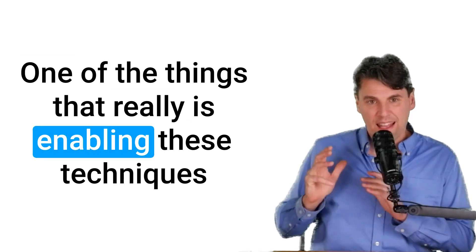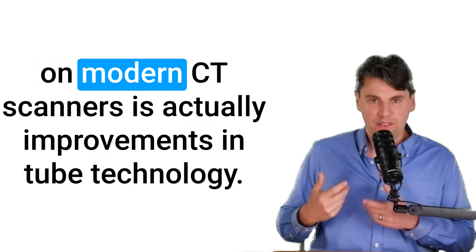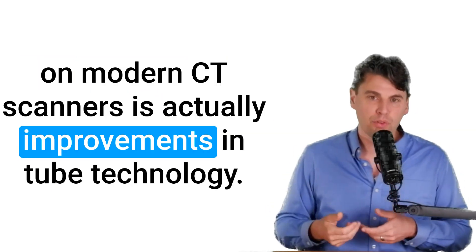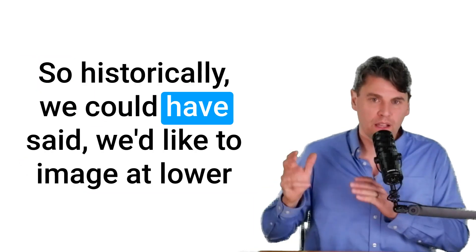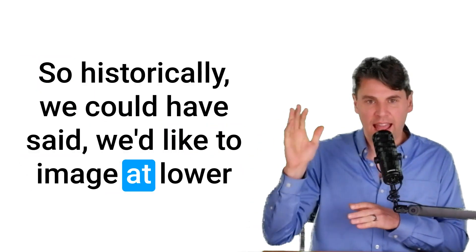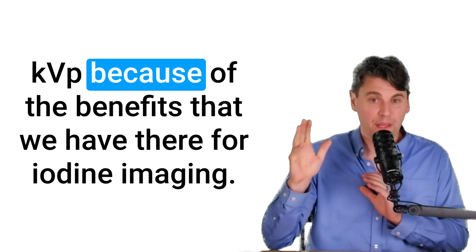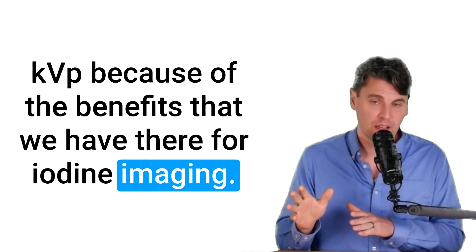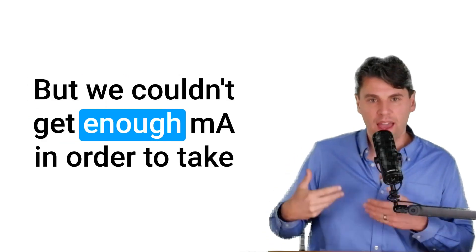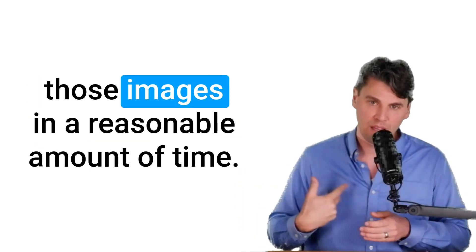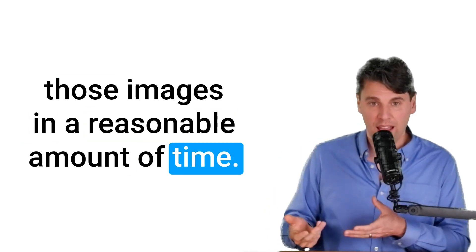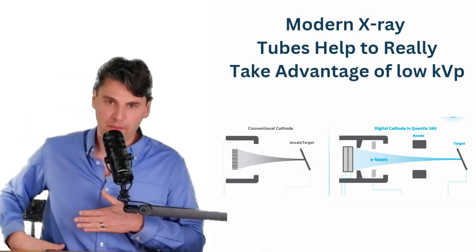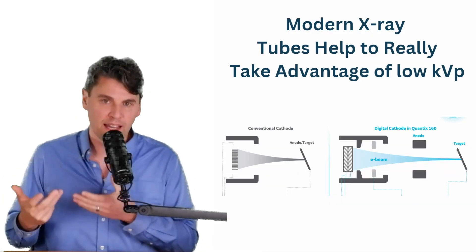So historically, we could have said we'd like to image at lower KVP because of the benefits that we have there for iodine imaging, but we couldn't get enough MA in order to take those images in a reasonable amount of time. The scans would have been very slow if we wanted to get enough MA.